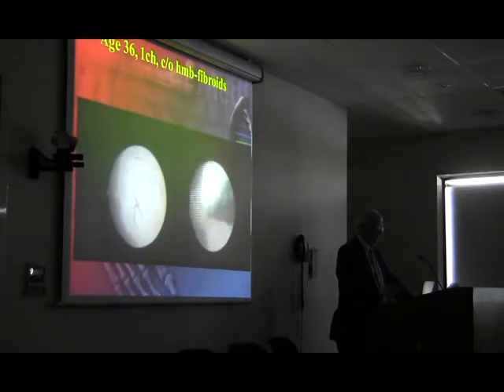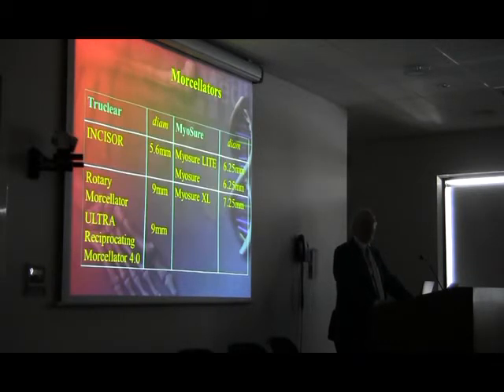I mean, you do it with the scissors, you do it with the Versapoint, you do it with the morcellator. Morcellator is more expensive, I don't know. No, here we are, morcellators.